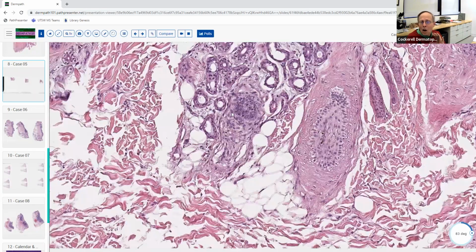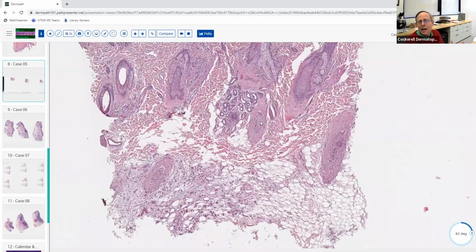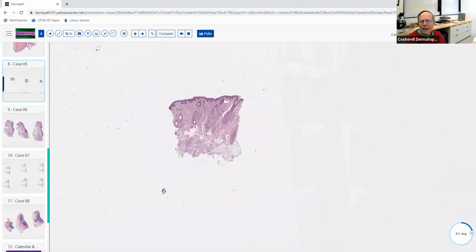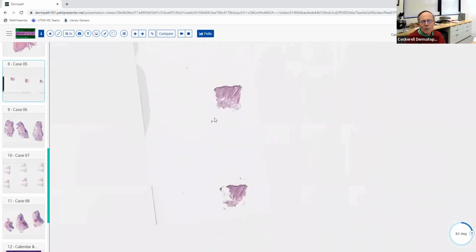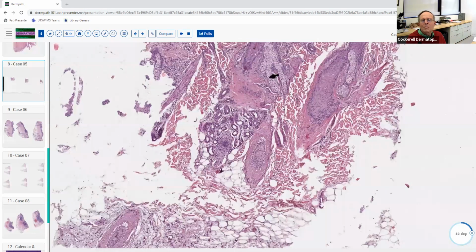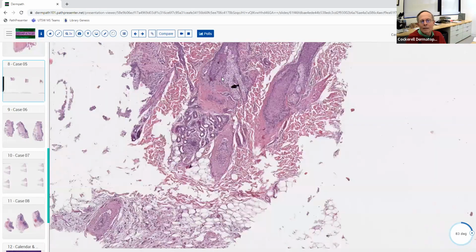Sometimes you get a relative paucity of inflammation, but everything gets shifted into catagen at the same time. And it's really the only disease that will do it like this. If they showed you something on the board, they probably would show you the more classic peribulbar infiltrate and some of that also. But I really want you to remember, this is virtually pathognomonic of AA when you see that. This one may have a little bit more inflammation over here possibly, but nothing else does this. So just remember that.